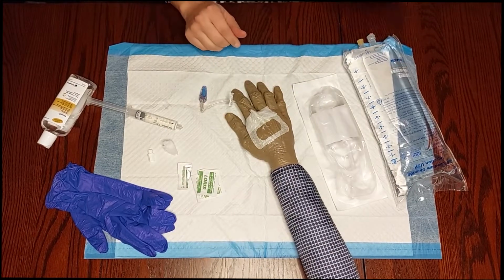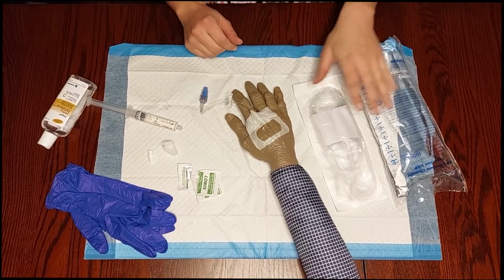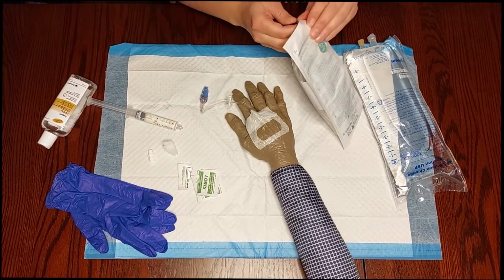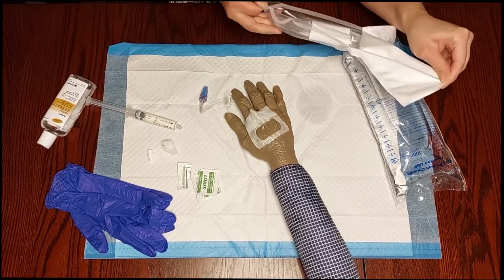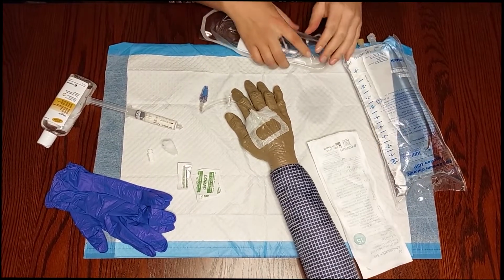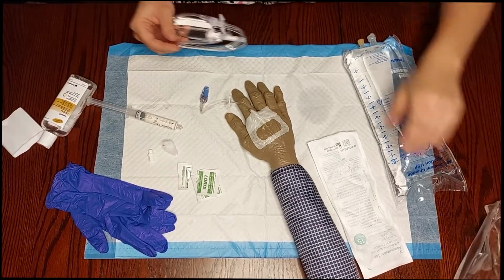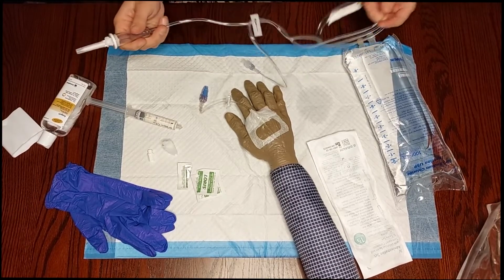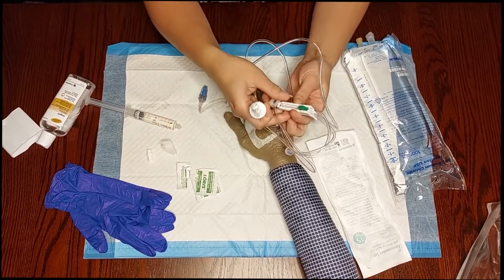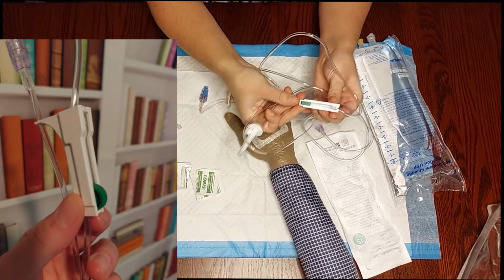We can get our IV hydration ready, or any medication, whatever we're running. So I do have the IV line, and we are doing this by gravity. We're going to want to keep this for our calculations of our drops per minute. Okay, so we have the IV line here. We are going to roll this all the way down to a stop position.